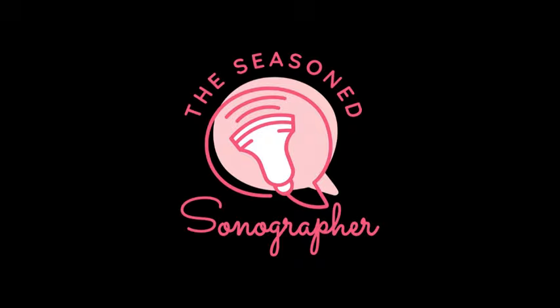If we have growth restriction. Outside of that, it's hard to say what to use it for. If you have normal growth and somebody just does a Doppler, you don't know why, and it happens. Sometimes people do them. And then you get this abnormal Doppler, and then we have to call maternal fetal medicine, like, well, I don't know what to do with that. Let's repeat this at a different time.